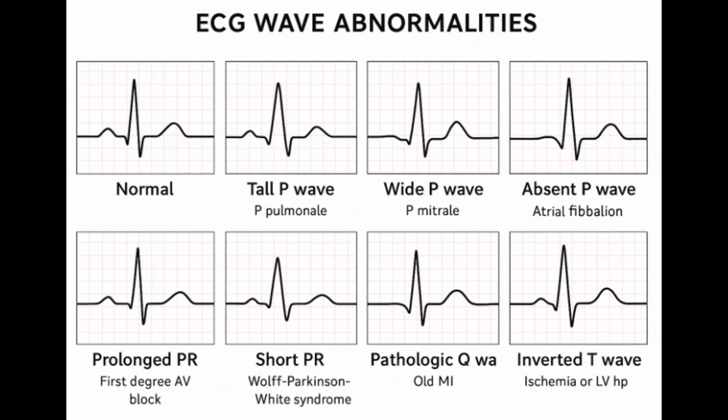And the really worrying thing is how quickly it can get worse. Okay, explain that progression. What happens next if the potassium keeps rising? Well, after the peaked T waves, the P waves start to flatten out, they get smaller, and then they can disappear completely. P waves just vanish. And then the QRS complex starts to widen, gets broader, kind of smeared out, because the high potassium slows down the actual conduction through the ventricles.